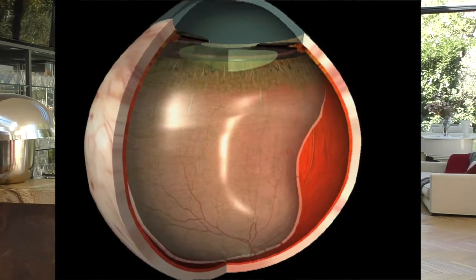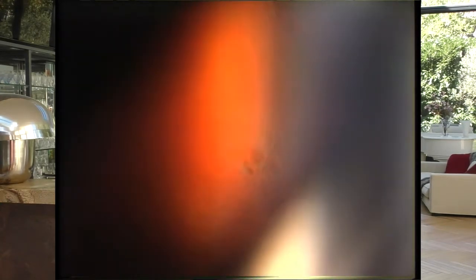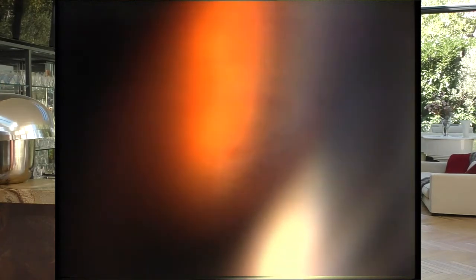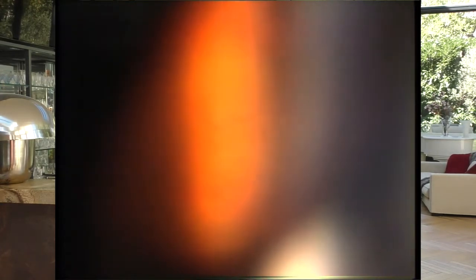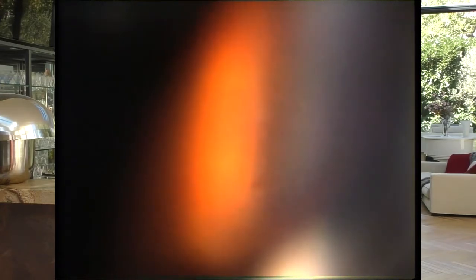If I insist so much on the need to identify these retinogenic detachments that represent 20% of the total of detachment, it is because performing a vitrectomy in these cases has serious consequences, because detaching an attached vitreous is not always easy.